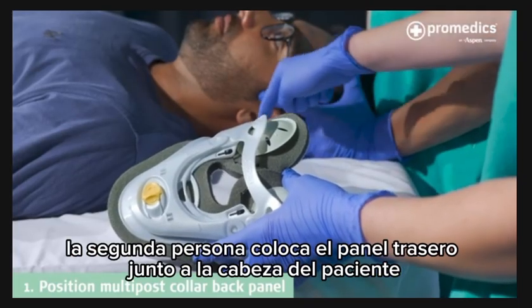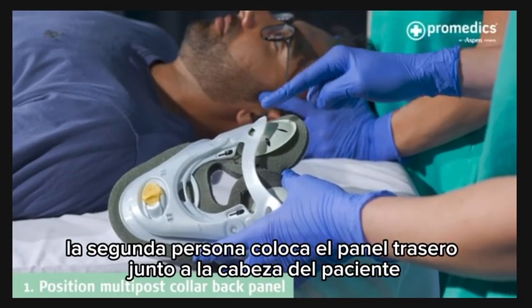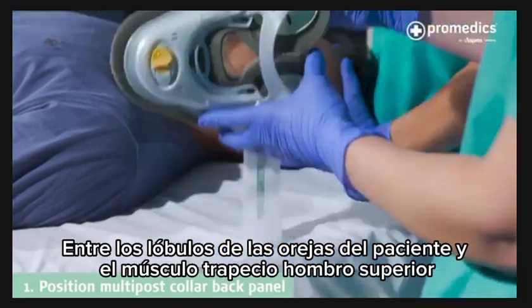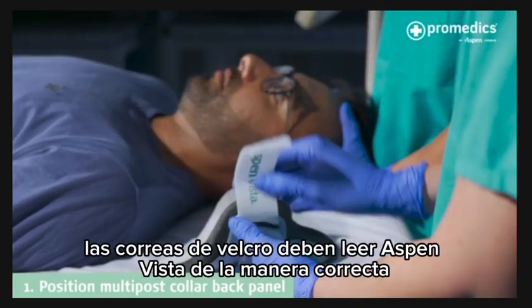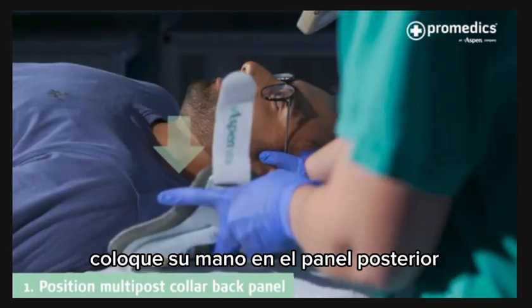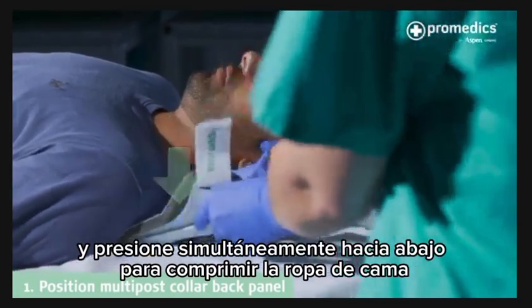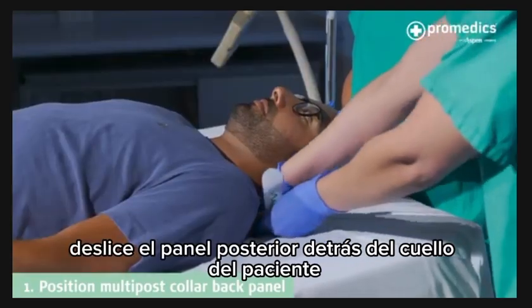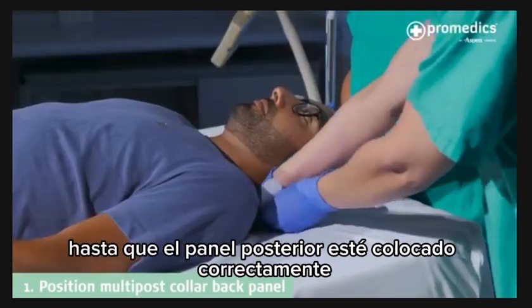The second person positions the back panel next to the patient's head, between the patient's earlobes and the upper trapezius muscle. The Velcro straps should read Aspen Vista the right way up to the person fitting the collar. Place your hand on the back panel and simultaneously press down to compress the bedding. Slide the back panel behind the patient's neck until the back panel is positioned correctly.